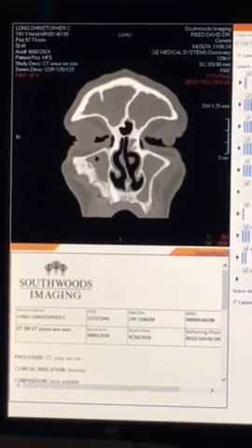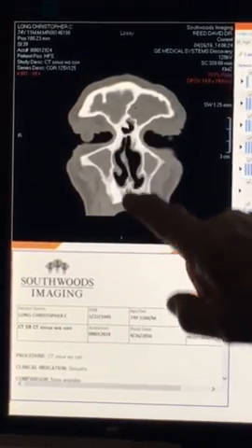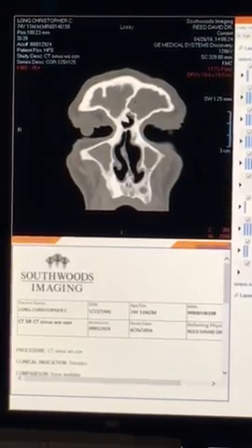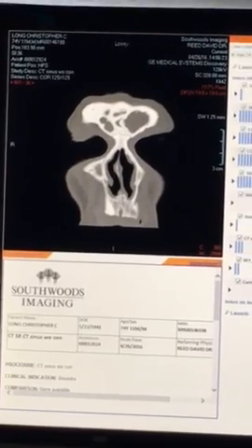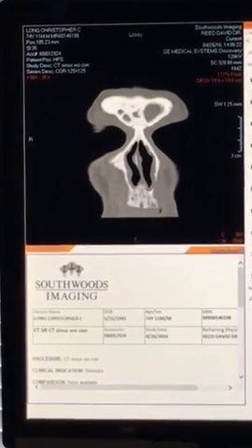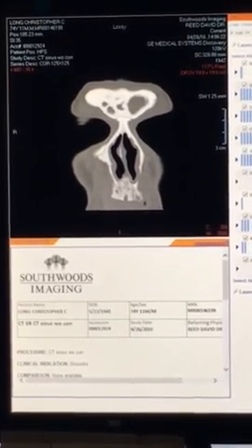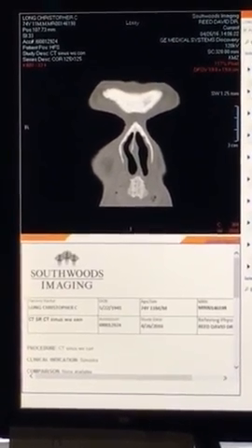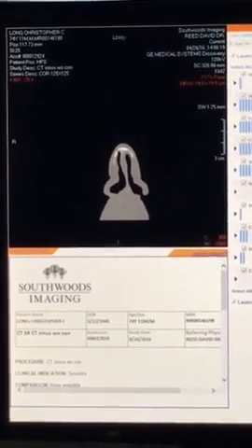You do have a little bit of a crooked cartilage, but I don't think that's causing any trouble. See your nasal septum? It's not perfectly straight, but that's not that bad. I doubt that that's a problem. I would suggest we should get you in to see somebody like Dr. Perlstein or maybe Dr. Babiak, they're doing this surgery all the time now, and they may be able to help you with this.